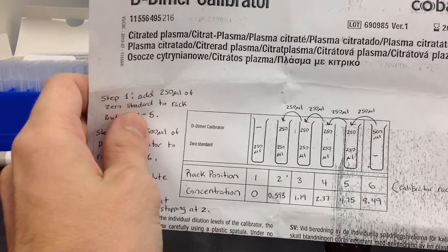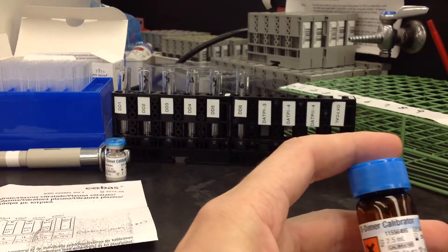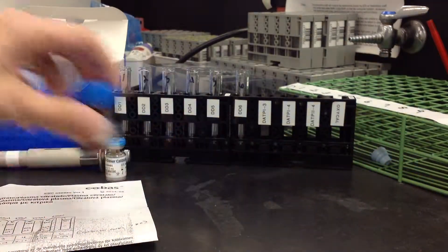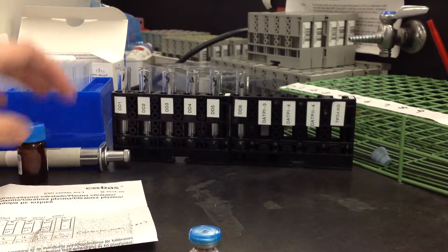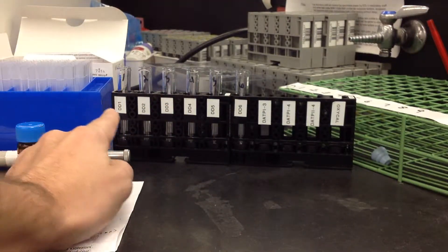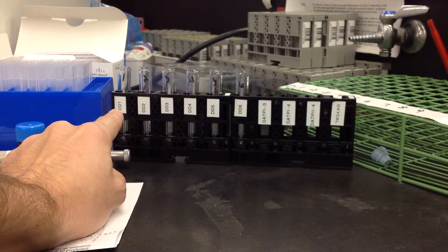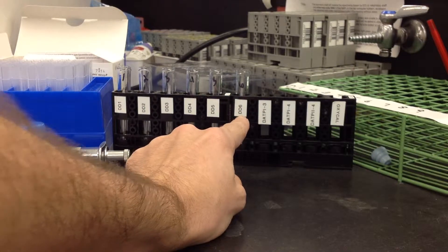The zero standard is the D-dimer Calibrator 1, and it's basically nothing — I don't know if it's DI water or what, but it has nothing in it. I also have my rack set up already. These are the racks that we use; they're labeled D-dimer 1 through 6, and 1 is our zero and 6 is the highest level of D-dimer.